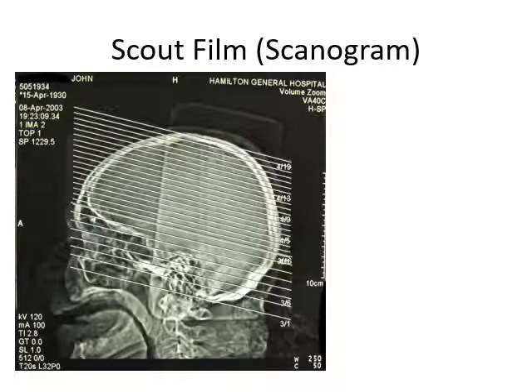Also, using the scale along the side, the radiologist gets an idea of how thick those slices are. And the last thing they get a good idea of is how many pictures are taken. So when they go to look, they're going to know there's like 1, 2, 3, 4. Each of these is a picture all the way down. And you can see down here at the bottom, they're probably not so concerned about whatever is down here. They're probably more concerned with what is actually up in the brain. You can see down here the slice gets a little bit thicker because they're probably not looking for anything.